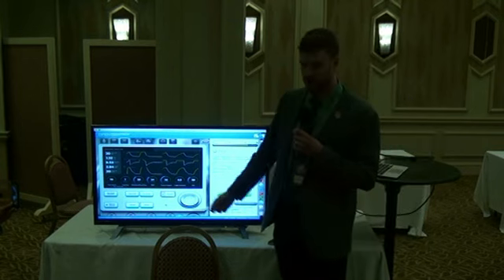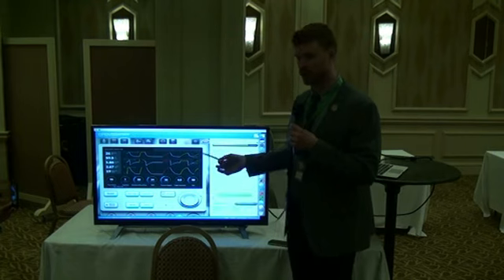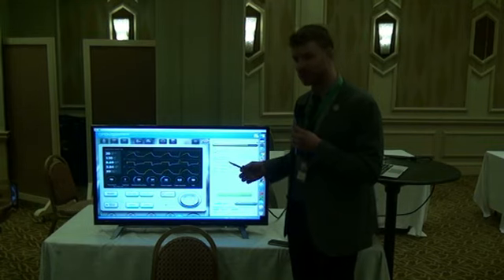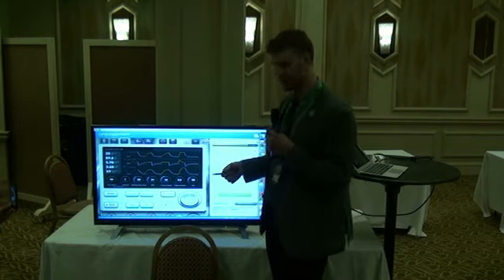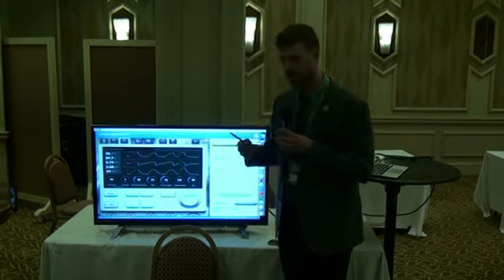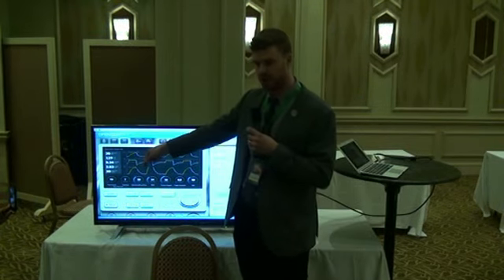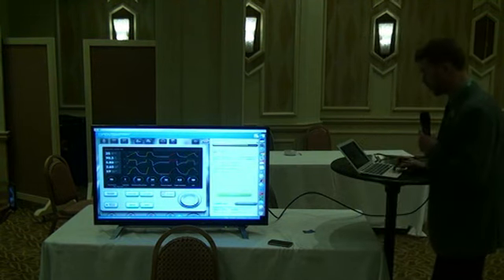So we're in volume control. So the volume control, it's always going to servo to that volume and just give more pressure. And so what we were doing was probably the opposite of what you would want to do with a pneumothorax, which would be like reduce the volumes so that the risk of accumulating that would go down. So what the machine was doing was like, I don't know what's happening. It just says, you set the tidal volume of 90 mLs, and I'm going to give you 90 mLs no matter what. And so what happened was the peak pressures were a lot higher, but the volume was the same. So that's why the volume didn't change a whole lot.